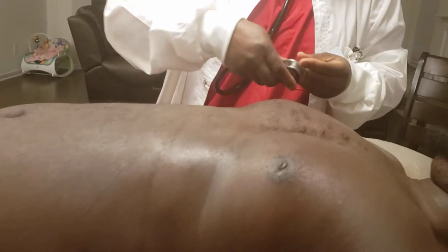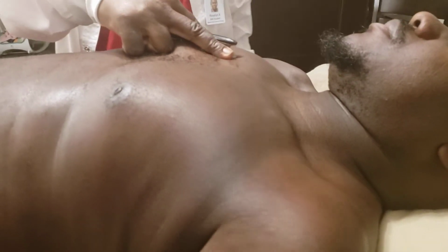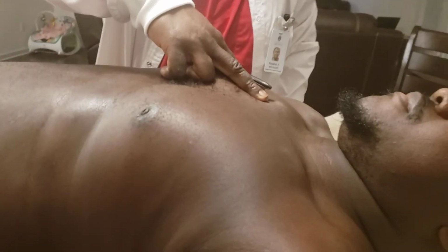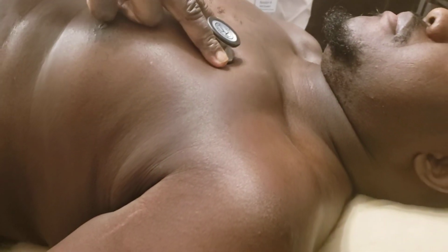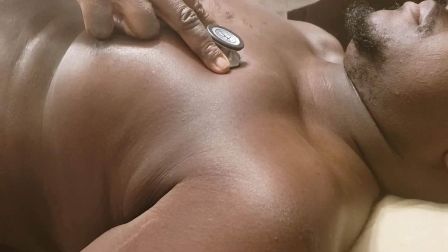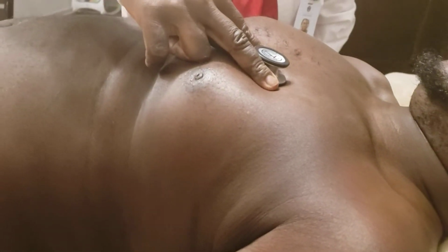I'll start the 5 locations by locating the second intercostal space, which is the aortic. Breathe normally for me. I'm checking for the S1, S2 sounds. This is the base area of the heart, and down is the apex. So this is the aortic valve area, between the second intercostal space. Then I move parallel to the pulmonic, on the left second intercostal space. And in the third intercostal space on the left, below the pulmonic, is Erb's point. Keep breathing normally for me.